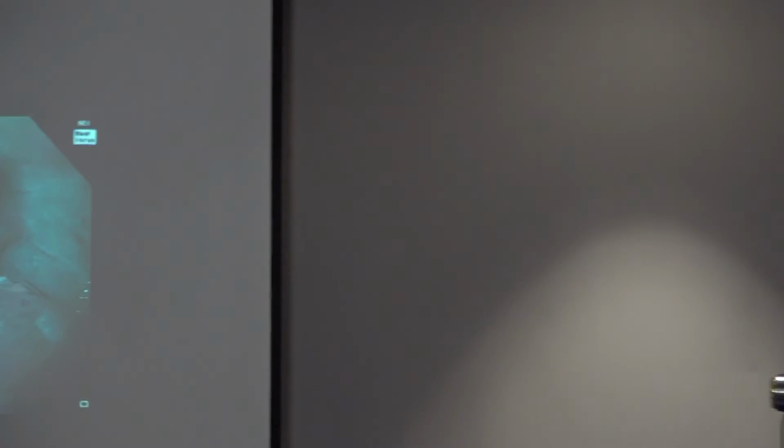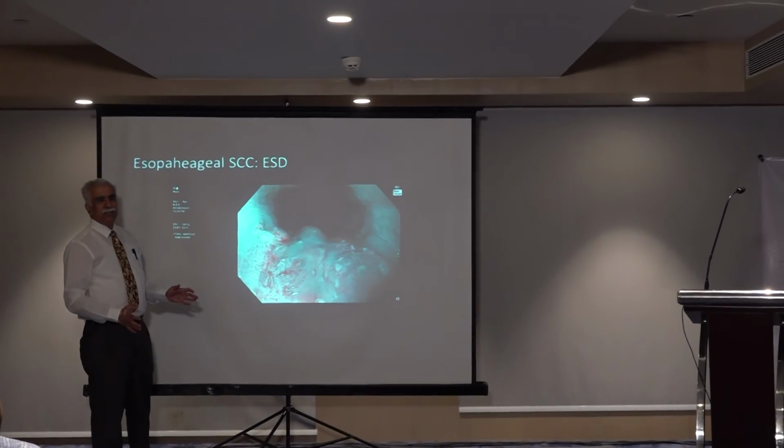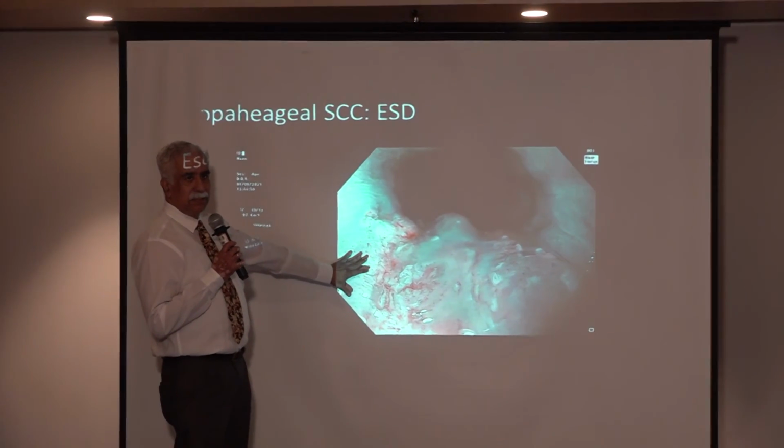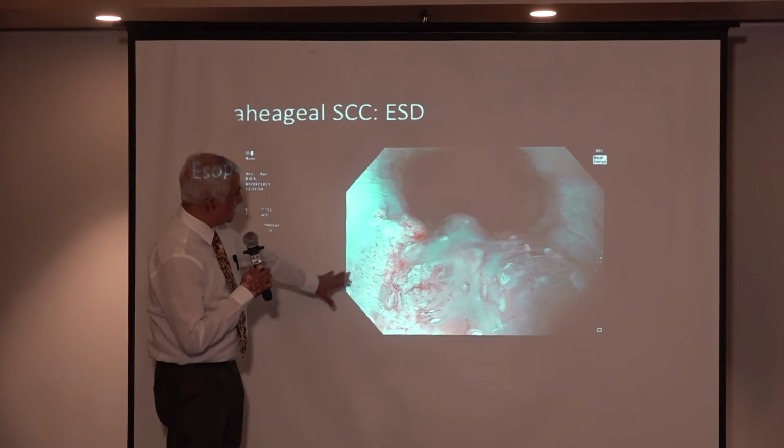And once you've found it on white light endoscopy, you want to confirm the IPCL and the depth that you can see. Here, you can see these IPCL, and in the esophagus, what we call them is A, B1, B2, B3. That's the classification of the Japanese society. A is normal, right? So this is not normal, it's a little more, so maybe inflammation or low-grade dysplasia. So this is certainly not malignancy. This may be inflammation, and this is at the periphery.